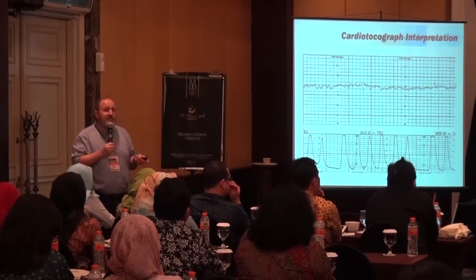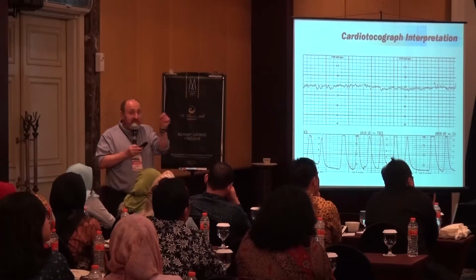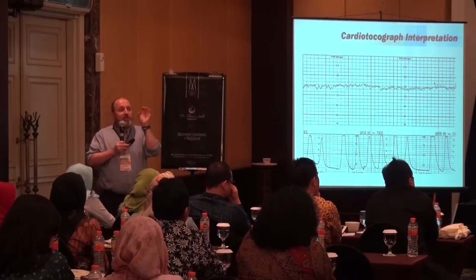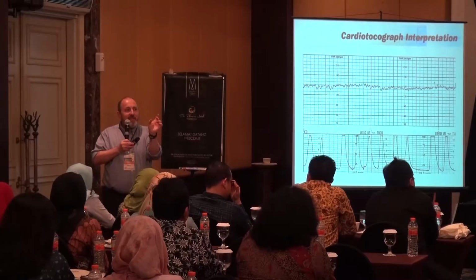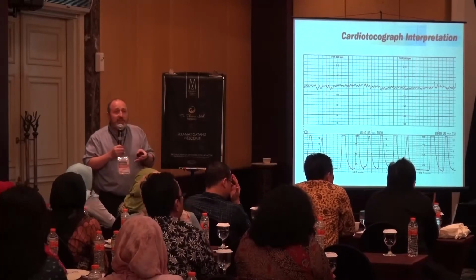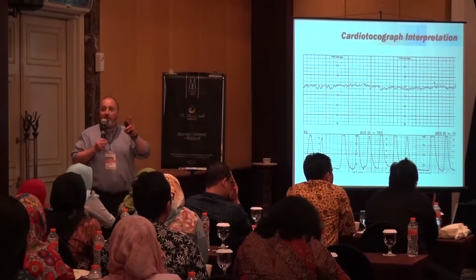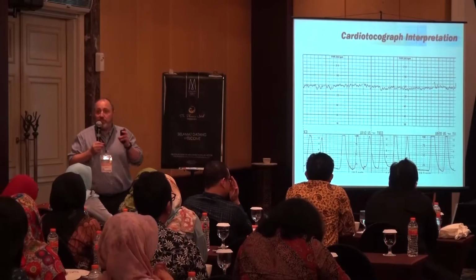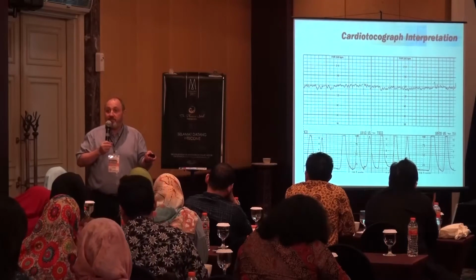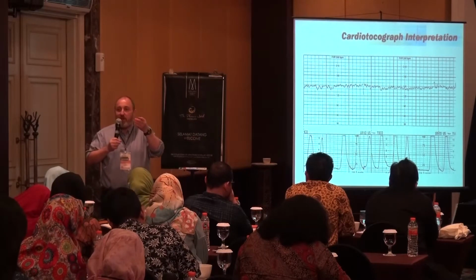The textbook sinusoidal tracing means you can cut out a minute and drop it on any other minute, and it'll match up. It's identical. But true textbook sinusoidal tracings rarely happen. True sinusoidal tracings are a concern because they're associated with 2 severe things, severe fetal anemia and severe fetal hypoxia. And they usually don't change in response to external stimulus because you can't reverse hypoxia. You can't reverse anemia. You can, but in the rigors of labor, you're not going to.